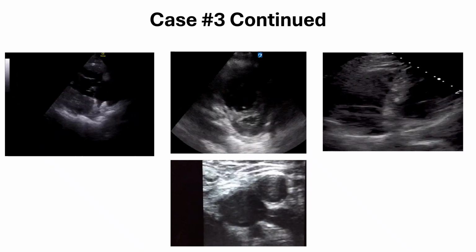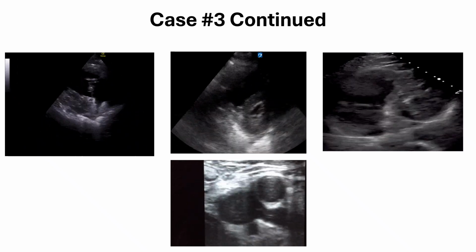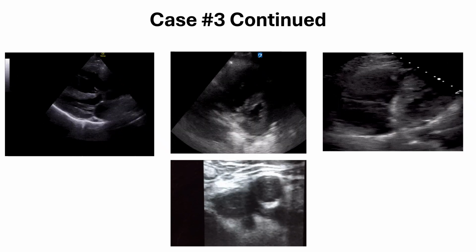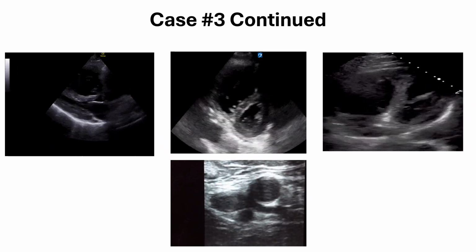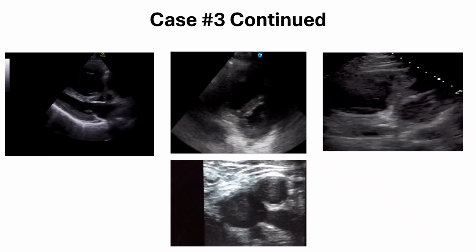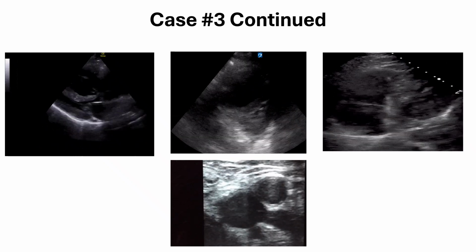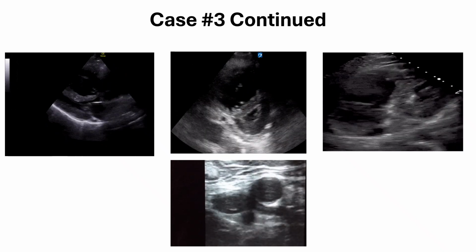And then you decided to screen for venous clots, and that's what you see when you compress. On the top right of a DVT exam image, you see the common femoral artery, and at the bottom left you see the common femoral vein. You see it doesn't really fully compress, and there is something floating within the lumen of the common femoral vein, which is a clot. Again, please take a moment to review this slide.